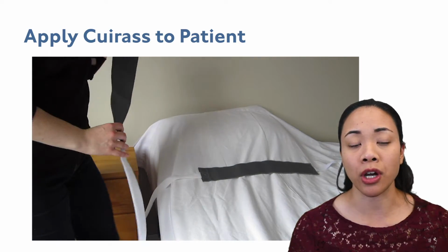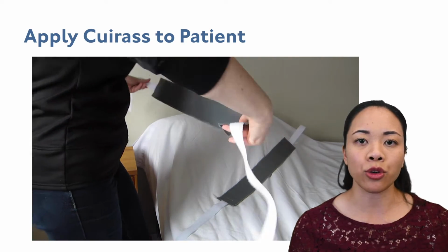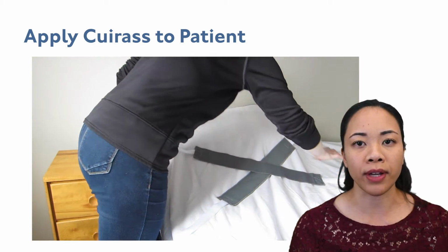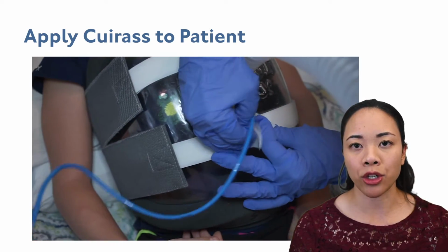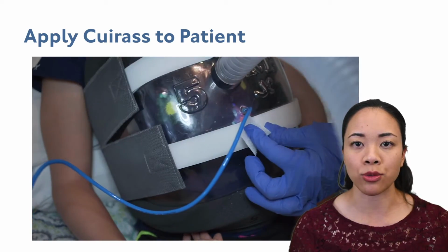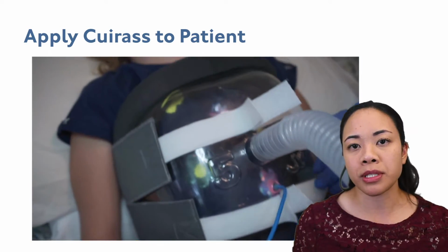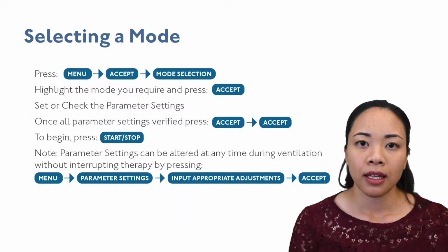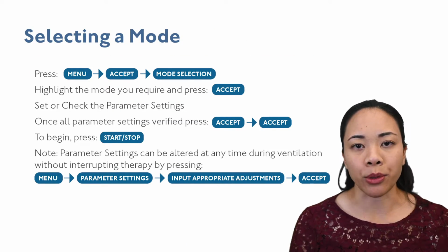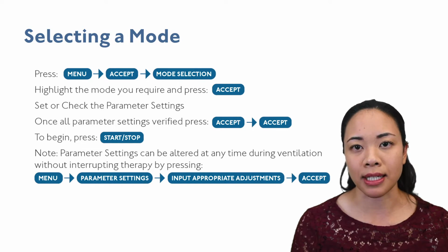Ensure the straps are not twisted in the back. They can be applied straight across or crossed in the back, whichever is most effective for the patient. Pull the straps snug so that they will not allow the Cuirass to move around on the patient's chest when ventilating. As a safety check, run your hand around the foam seal to ensure that there are no leaks. To navigate to the desired mode, please follow the step-by-step procedure highlighted on page 6 of your booklet.